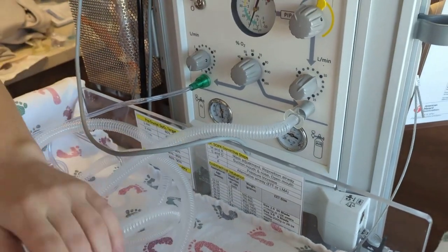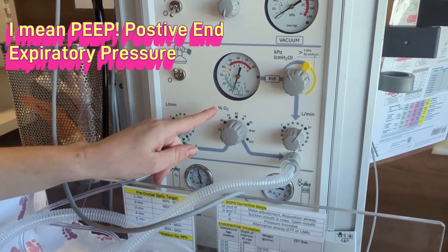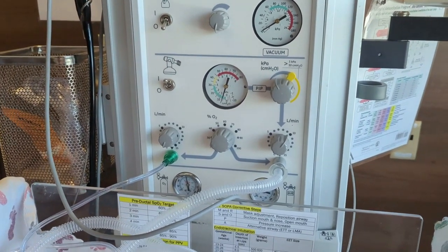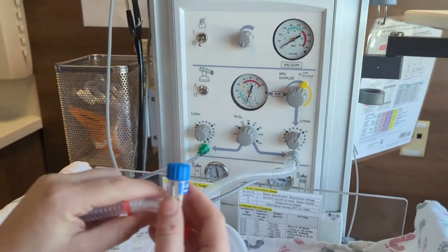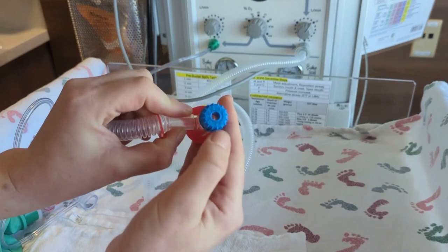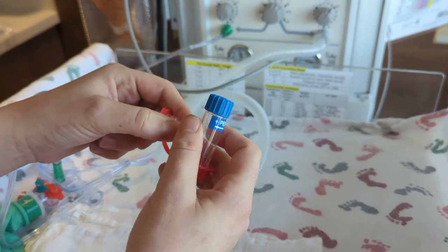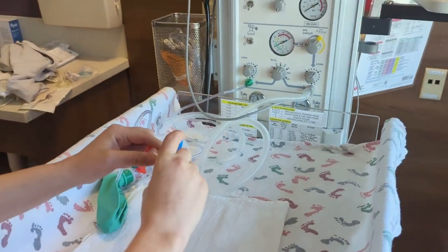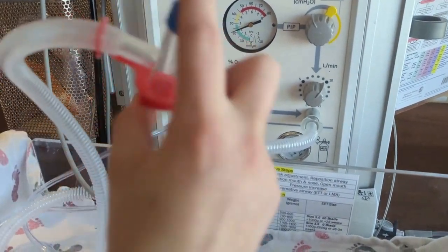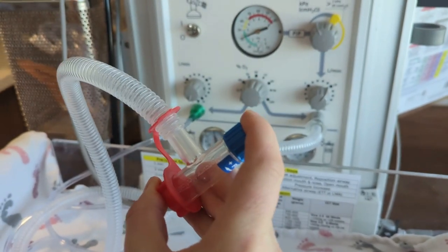What I'm checking for here is my PIP — positive inspiratory pressure. It helps to check this when you're standing at the head of the bed. To adjust our PIP, use this dial here labeled PIP plus or minus. Sometimes this cap is white. We check the PIP by fully occluding the circuit, and we want our PIP to be at about 20.